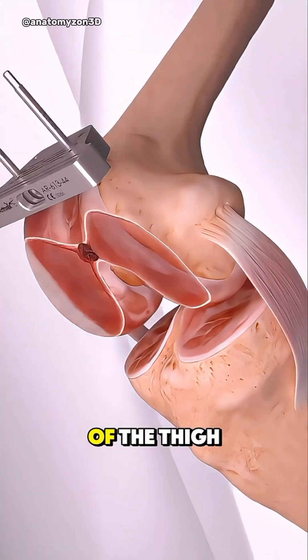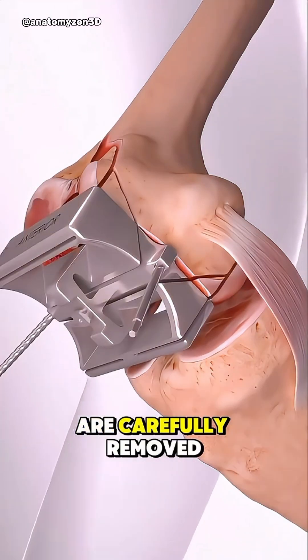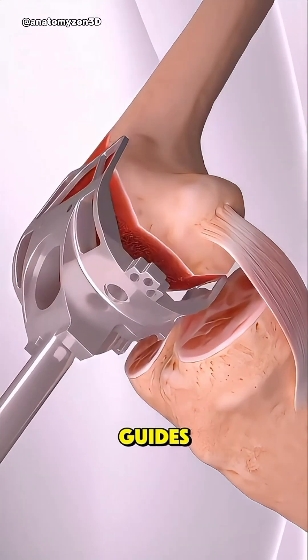The damaged surfaces of the thigh bone, shin bone, and sometimes the kneecap are carefully removed using precise cutting guides.